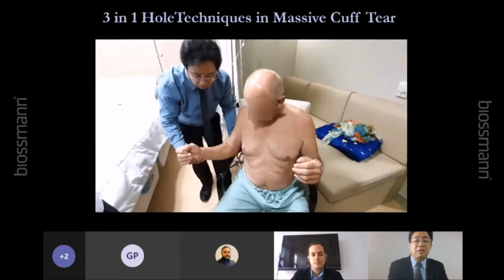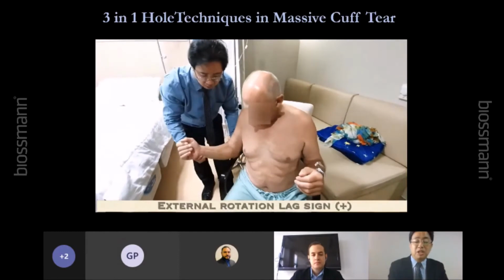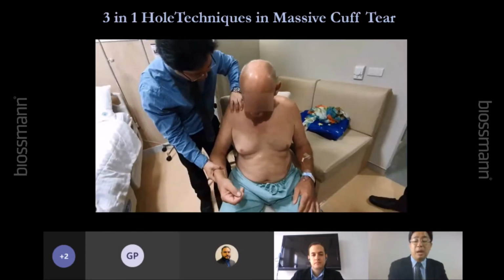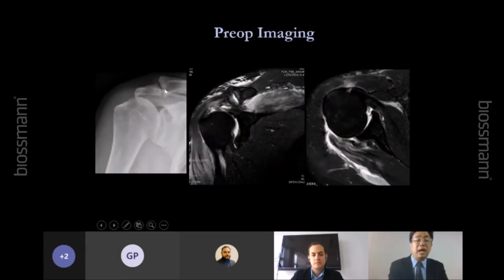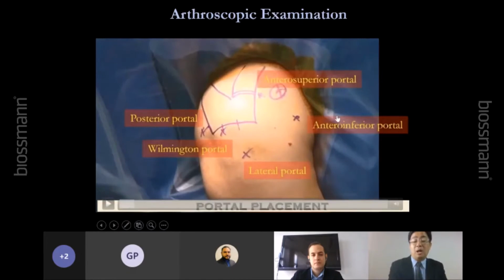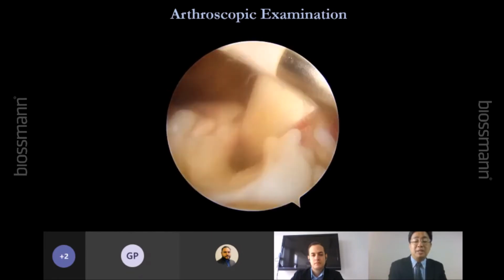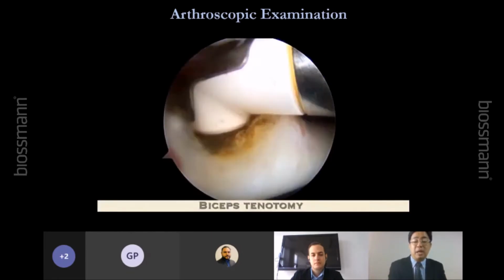So this is a very massive cuff tear, a traumatic cuff tear for 6 months, external rotation lag side positive, pseudoparalysis, okay, and also bicipital pain. So you see that the patient has proximal migration. I discussed with him about the reverse or trying to repair the cuff, okay, because this is 6 months and the patient has pseudoparalysis, and also has supraspinatus and infraspinatus torn. So when we get in, we found that the patient has a very big size tear, supra-infraspinatus, and the retraction is so far.